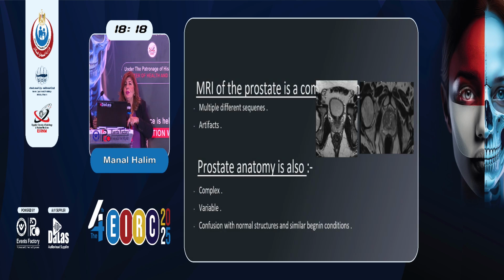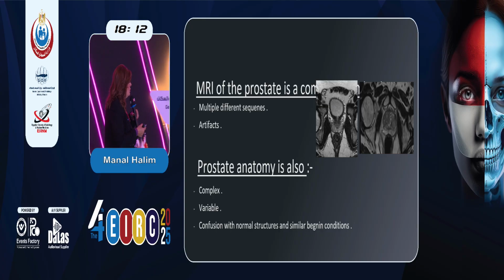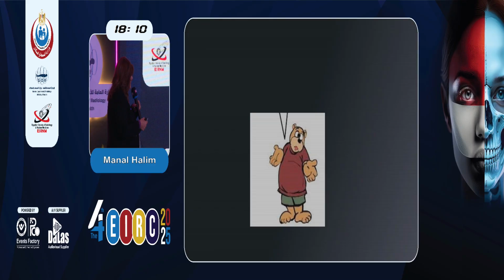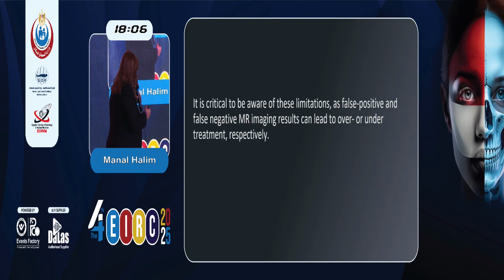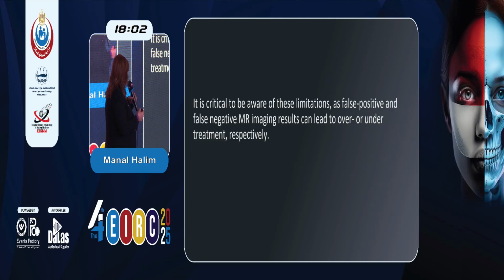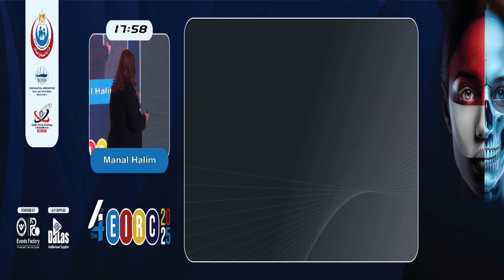And the confusion with the normal variants, okay. And the confusion with normal structure and similar benign conditions. And we can say that it's critical to be aware of these limitations, as false positive and false negative MRI imaging results can lead to over or under treatment respectively.